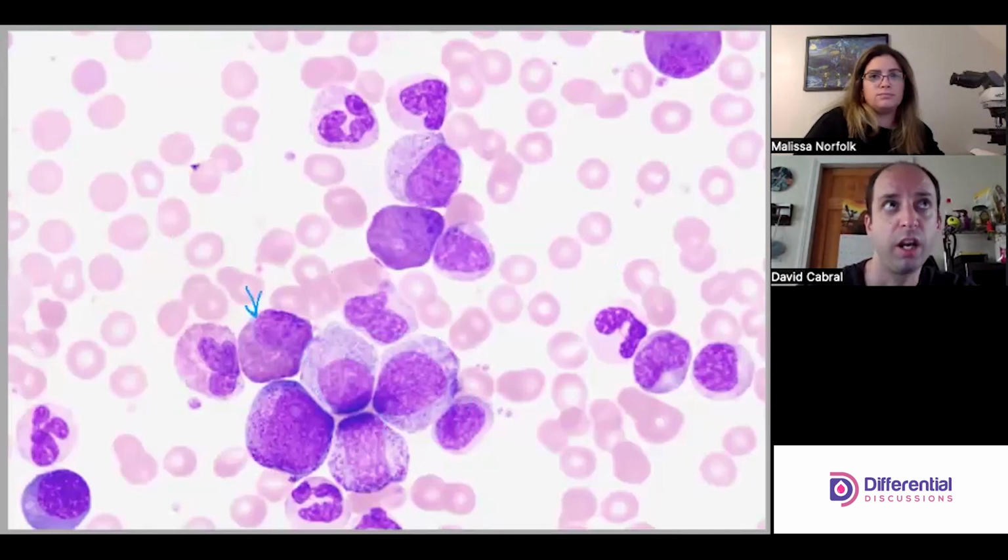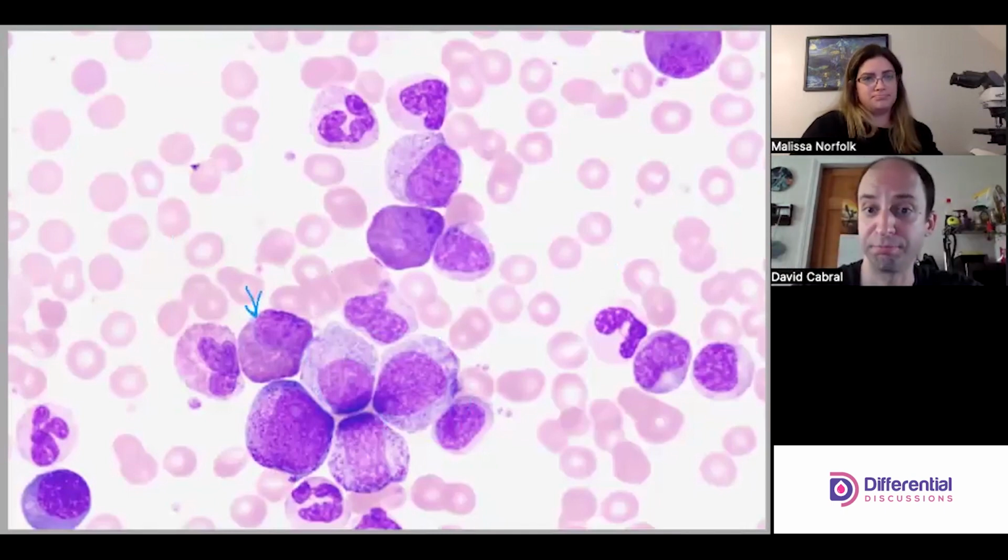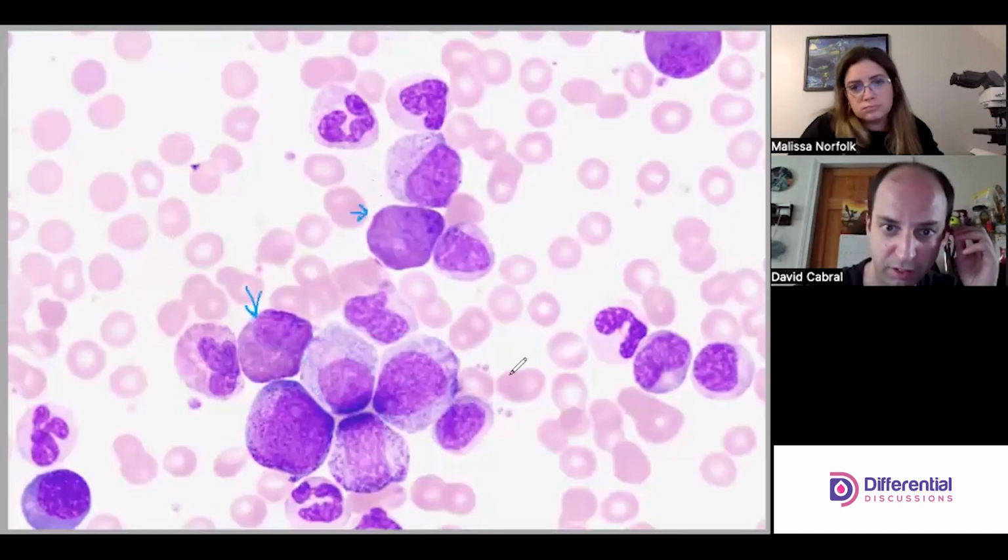I know you're used to your bilobed EOs, right? But before an EO grows up into its bilobed form, it looks much like a lot of the granulocytic lineage and progression. Goes for the number of granules too. You might have an EO that doesn't have a ton of granules yet, perhaps. And so there's two of those in this field, right? So if we skip ahead and go up a little bit, we have another one. Yeah, and so it depends on the institution.